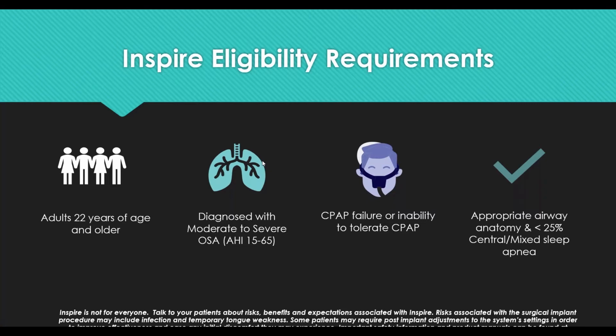People who are in law enforcement, you have to know which hand is the hand that their firearm is in because you do not want a gun to recoil into the device. People who do professional diving, you have to know how far down they're going to travel, what their distance is, because the device is only rated for about, I think, 100 meters down.